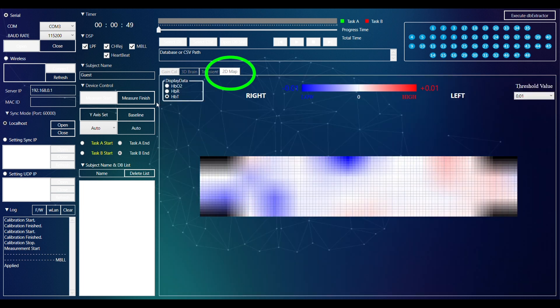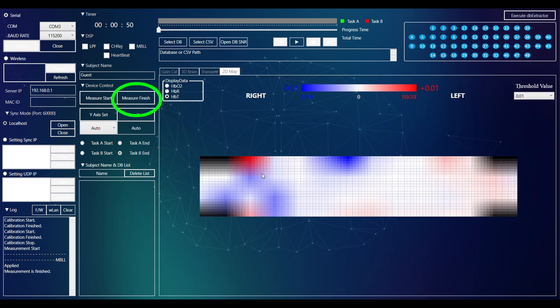The recording can be stopped by clicking on the Measure Finish button and clicking OK to save the recording.